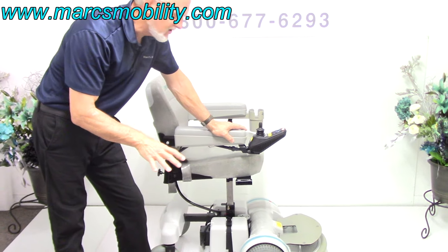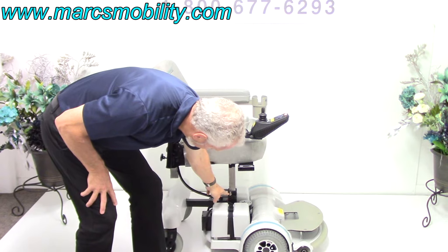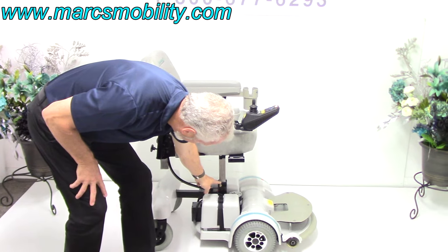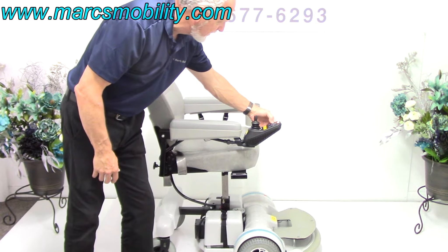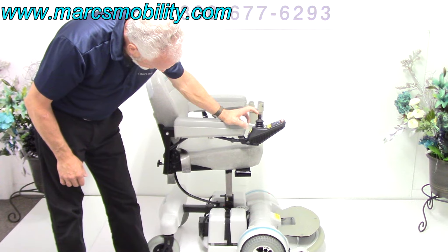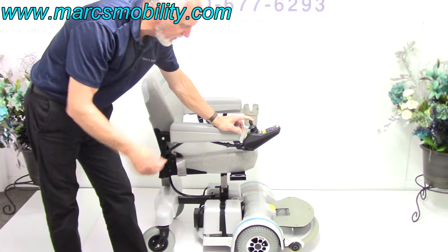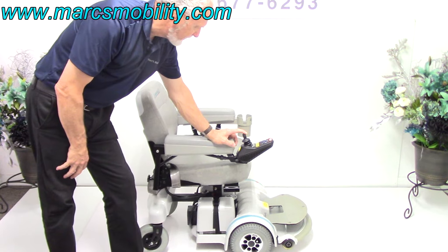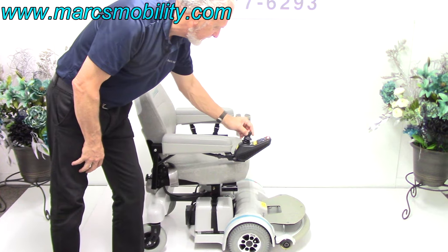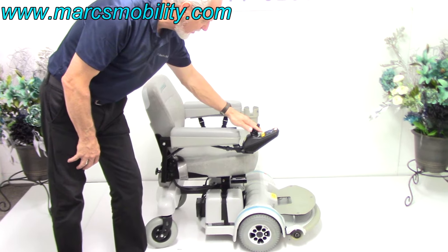Hover-Round does not let you drive with the seat elevated. If you want to drive, it has to go back down and hit this sensor right here. Once it touches this sensor, then you can drive again. So if I put it back down, as soon as it hits that little sensor in the bottom, it clicks up, and now you can start driving. You've got to put it back in drive, and now you're ready to go.